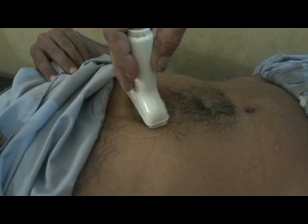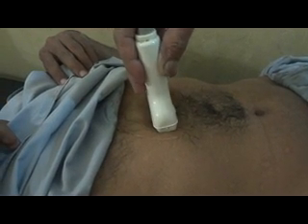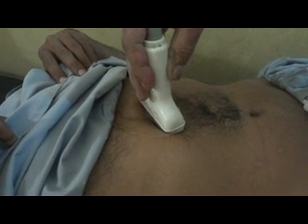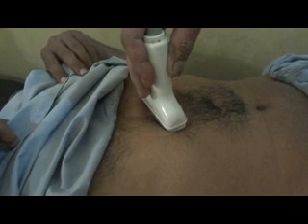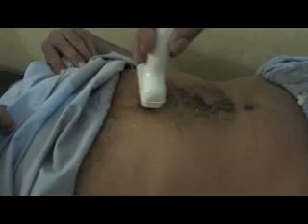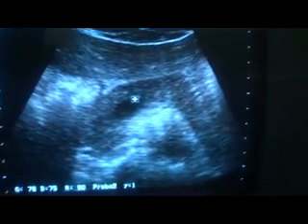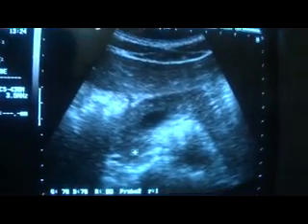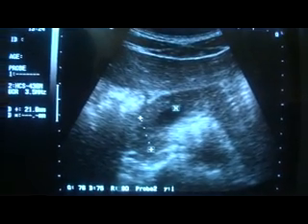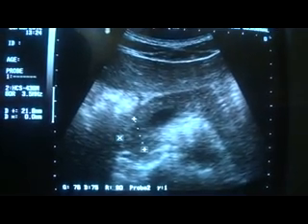again you see, now I move the probe cephalad towards the patient, angle the probe towards the patient's head, and ask him to take a slight deep breath and hold it, and I give a little pressure, and you see this is the aorta, this is the celiac axis, this is the curved vessel. So the differentiation is that the splenic vein will go straight and then it will curve, but it will curve towards the tail of the pancreas, not towards the body of the pancreas. So this is the splenic artery arising from the celiac axis.